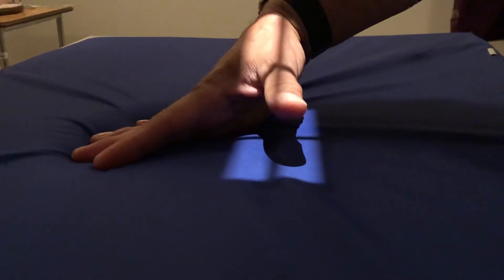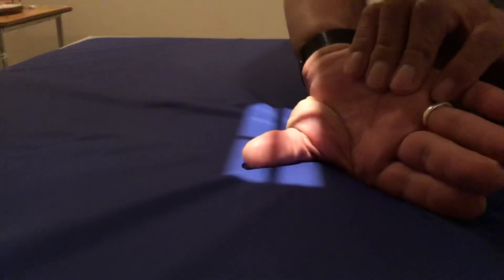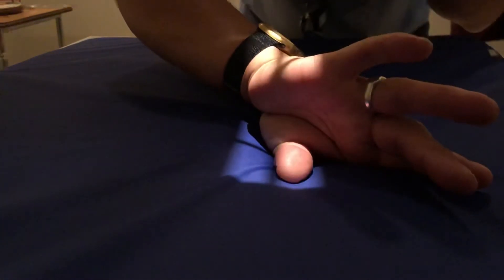And if you have to do an AP, then you've got to flip the hand all the way over and over-rotate a little bit, so you can get the fat pad out of the way here. Otherwise, it's going to be very light at the base of the thumb.